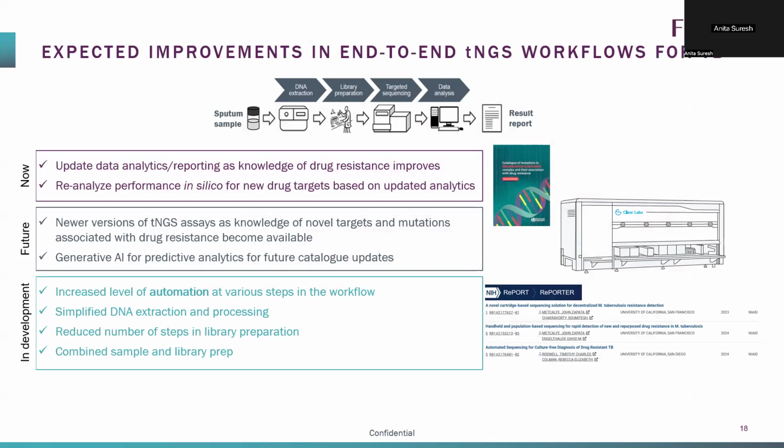Many of you have utilized sequencing now for COVID, for mpox, and so on. So there is that capacity that exists, the training, the personnel that exists with sequencing. So you want to be able to utilize it, but to build it on for TB, there are still some gaps or some improvements or additions that need to be made to truly make it viable as a large scalable solution.